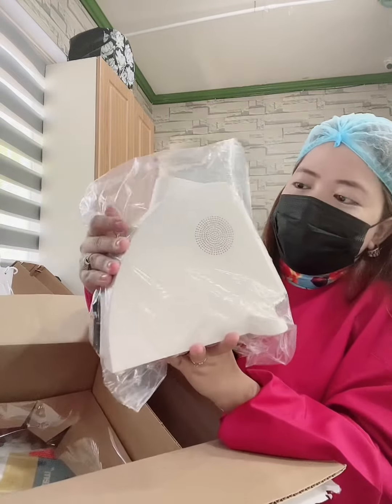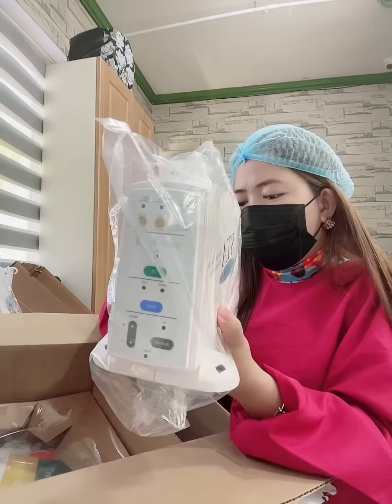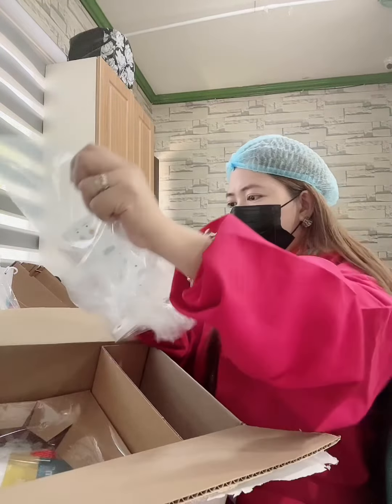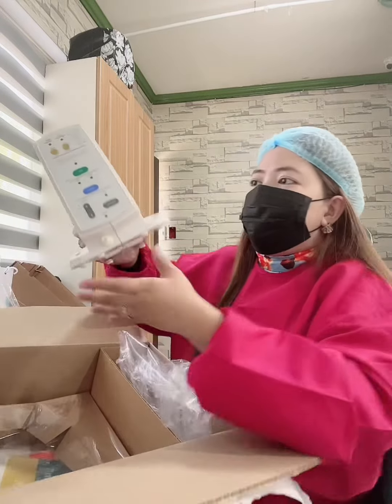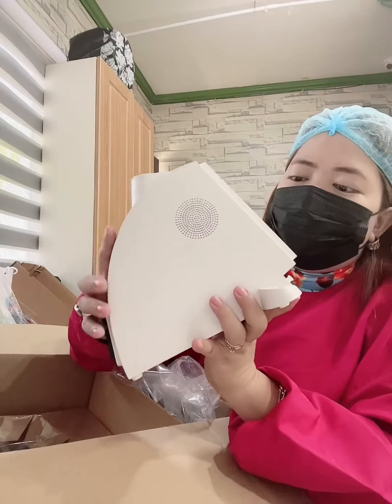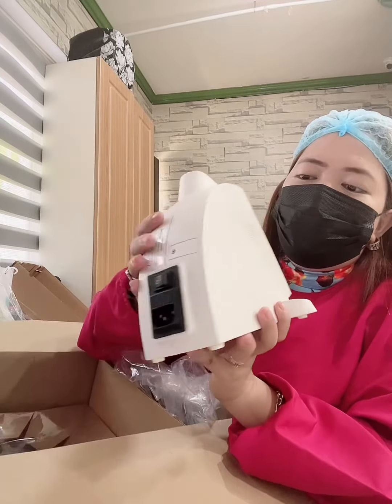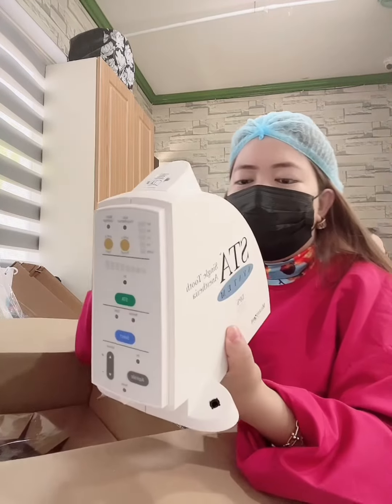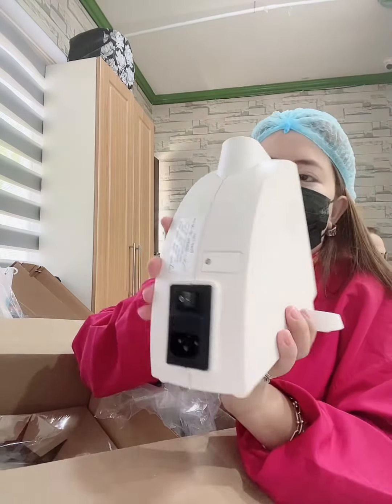And here's the machine. It's the motor. It will talk and talk and talk. Yes, single tooth anesthesia. It stops once there is too much pressure during deposit of the anesthesia. So it's from Germany.